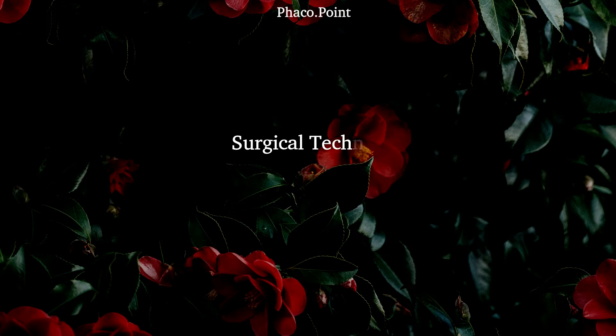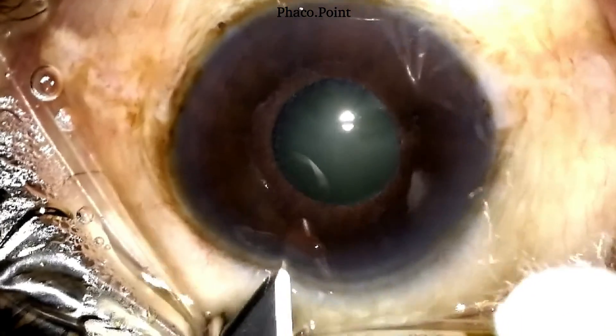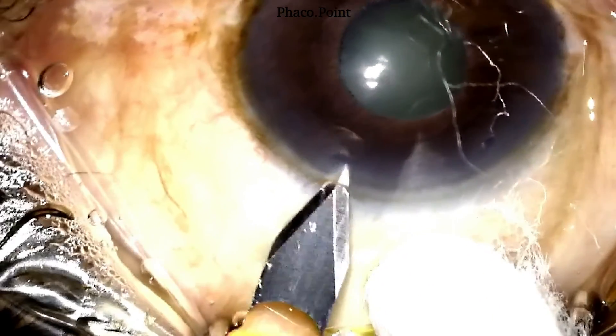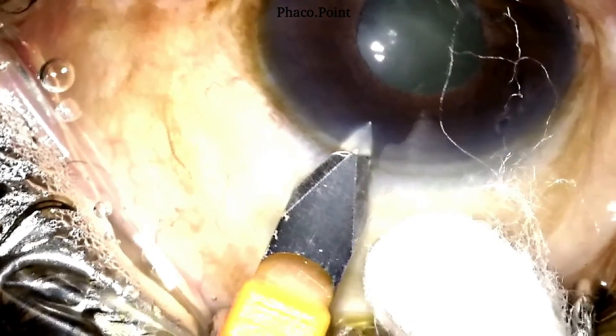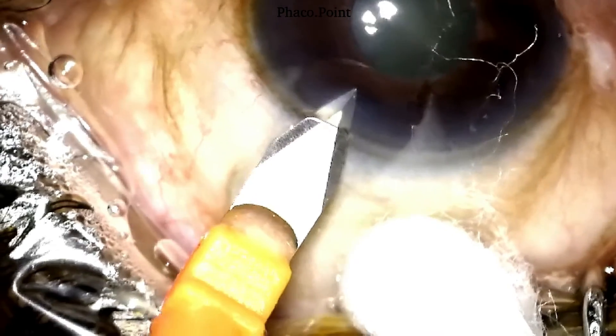Having understood the principles of creating the clear corneal tunnel, let's move to actually watching the surgery. In this case of pseudoexfoliation, watch the clear corneal tunnel — it's made by me, a left-handed surgeon, at 65 degrees, and it is 2.8mm wide and about 2mm long.